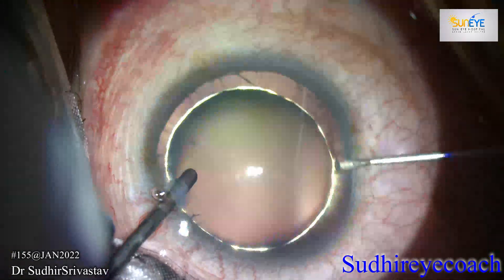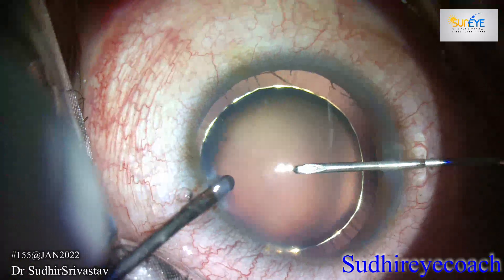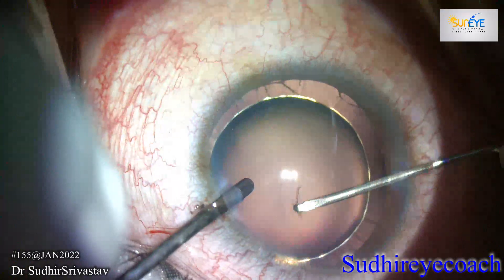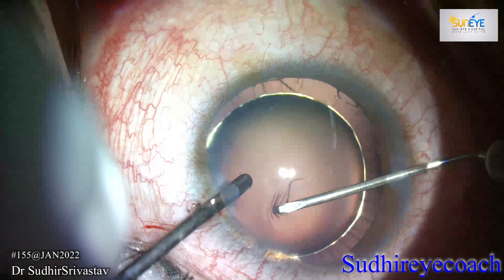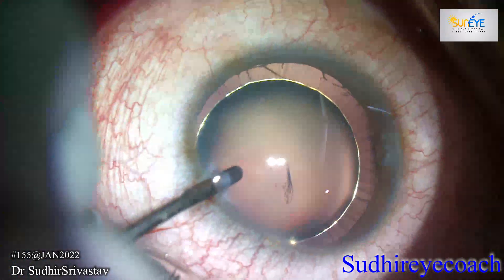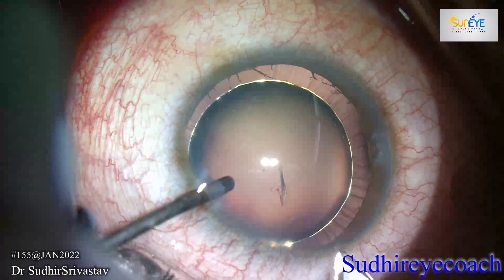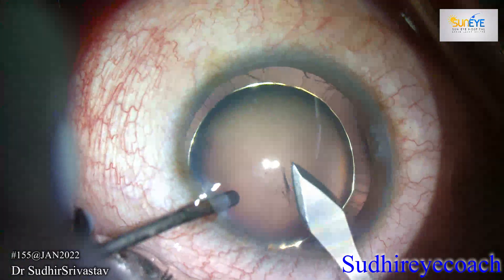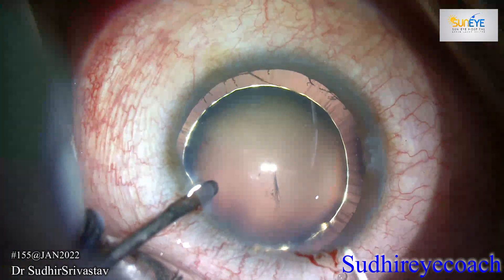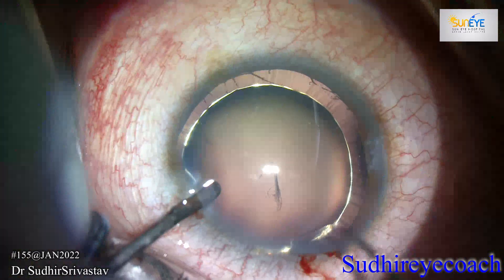During the manipulation of the capsule, we can get an idea regarding capsular behavior and zonular strength. I created a linear puncture in the capsule and you can feel the behavior of the capsule. Because of the laxity, propagation of the capsulorrhexis was not normal, so I created a clear corneal main incision.